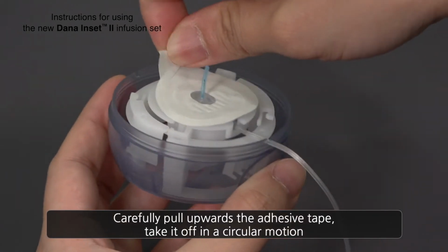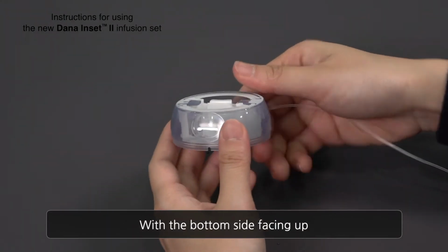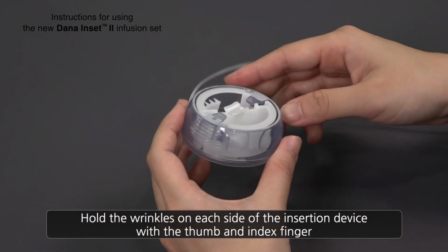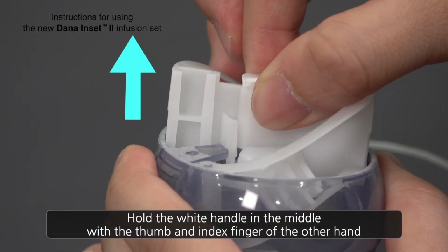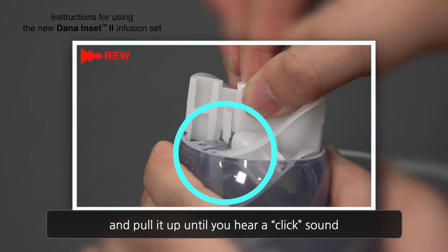Carefully pull the adhesive tape upwards, taking it off in a circular motion. With the bottom side facing up, hold the wrinkles on each side of the insertion device with the thumb and index finger. Hold the white handle in the middle, with the thumb and index finger of the other hand, and pull it up until it's locked, with a click sound.